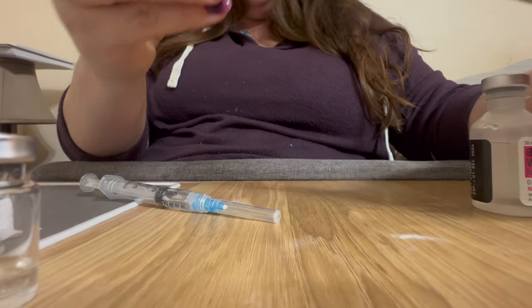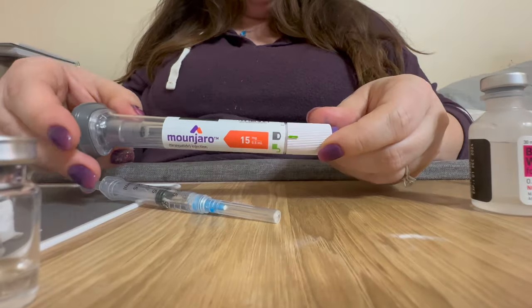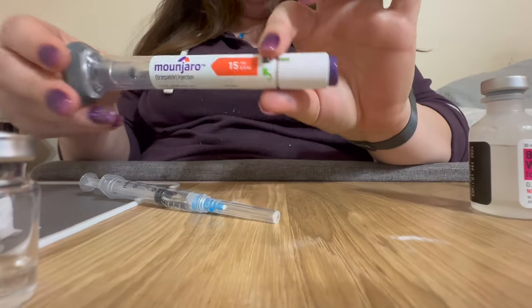I'm going to put the cap back on the pen. You can see it's never been unlocked and the button is still on — this is an unfired pen.